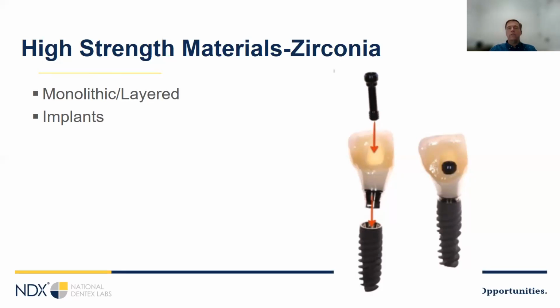Zirconia gives us nice, as you know, shade control of underlying discoloration, either from dark preps or titanium abutments. But zirconia isn't magic. You need a certain amount of depth to get that shade control. So if the reduction's not quite enough, sometimes we can still see a little bleed through. When we're making the case in the laboratory, if we see a little bit of grayness from an underlying metal abutment, sometimes a gold hue or an anodized abutment can really be nice.